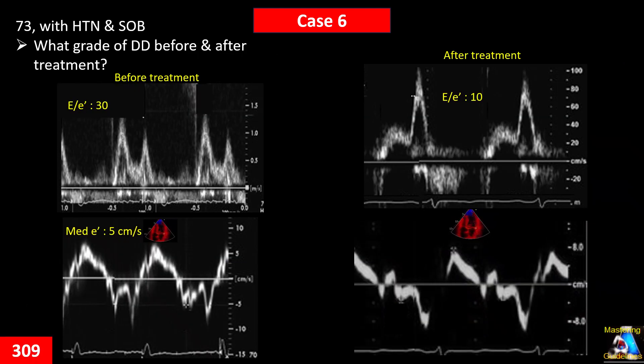Here we have a 73-year-old patient with hypertension and shortness of breath. The patient was hospitalized and treatment with diuretics and antihypertensives was started. After a few days, the echo was repeated. Here is the echo before treatment, and here is after treatment. What type of diastolic dysfunction did the patient have before treatment, and what happened after treatment?